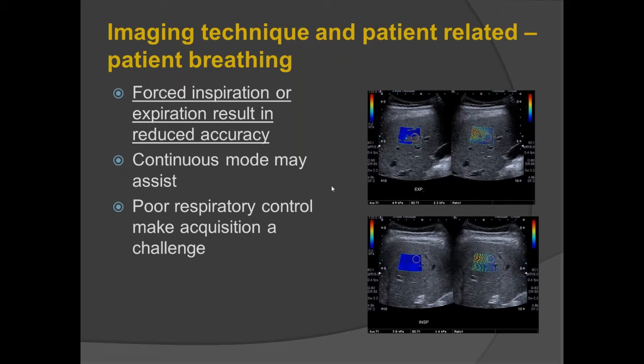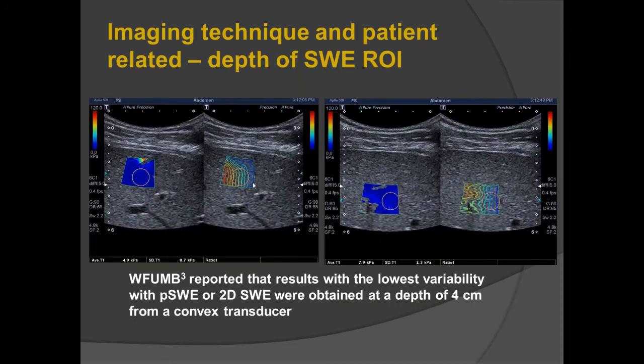And as I said, as this Teal's study found, if you can watch an elastogram consistently for 3 seconds and it's homogeneous, you can use it for an elastography assessment.